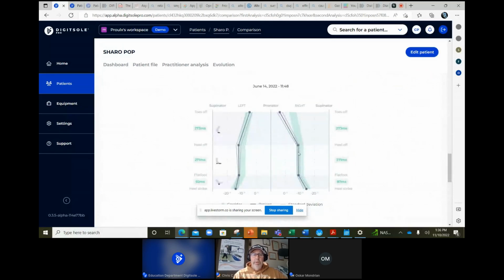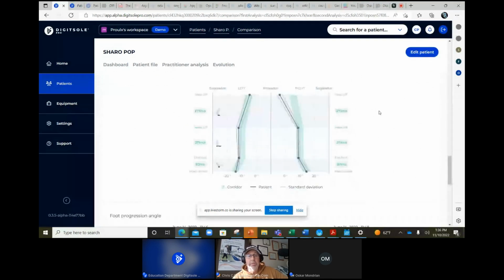And this is the new one. So when we had her walking faster, basically it was the exact same pattern. So she wasn't improving, and we really had the same issues as we did when she was walking slower. So she's definitely involving some compensatory strategies as a result of what's going on.